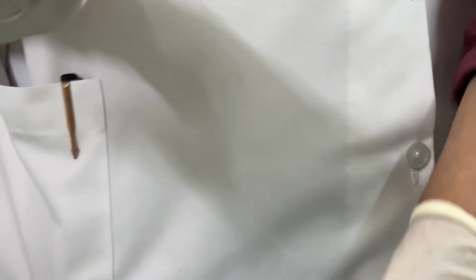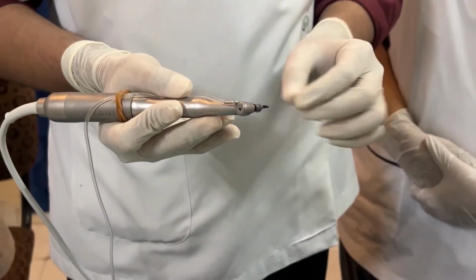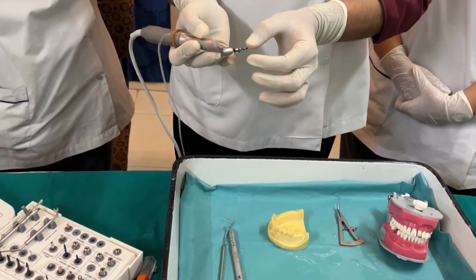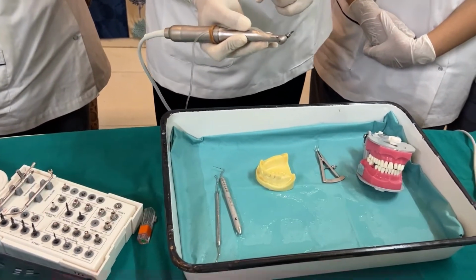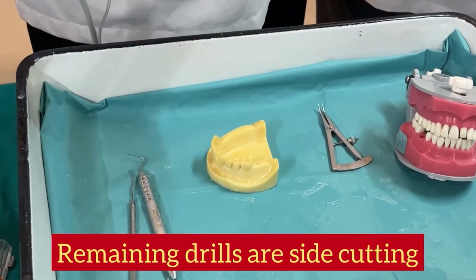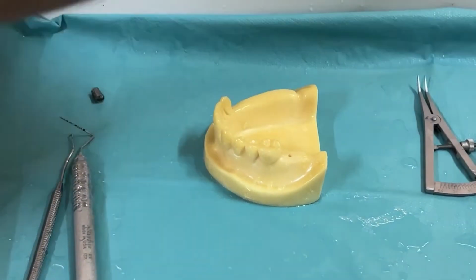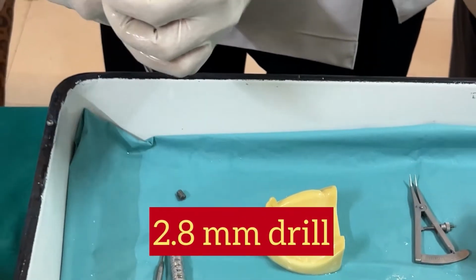So did you notice this drill went a little bit more easily than the first drill? Please understand, only the 2 millimeter and maximum 2.4 millimeter are the end cutting drills plus side cutting. The remaining drills are only side cutting drills. They only increase the diameter, they don't increase the depth. They sink in very easily. So again the same thing repeated. So the next drill is 2.8. All of you are getting this thing once.